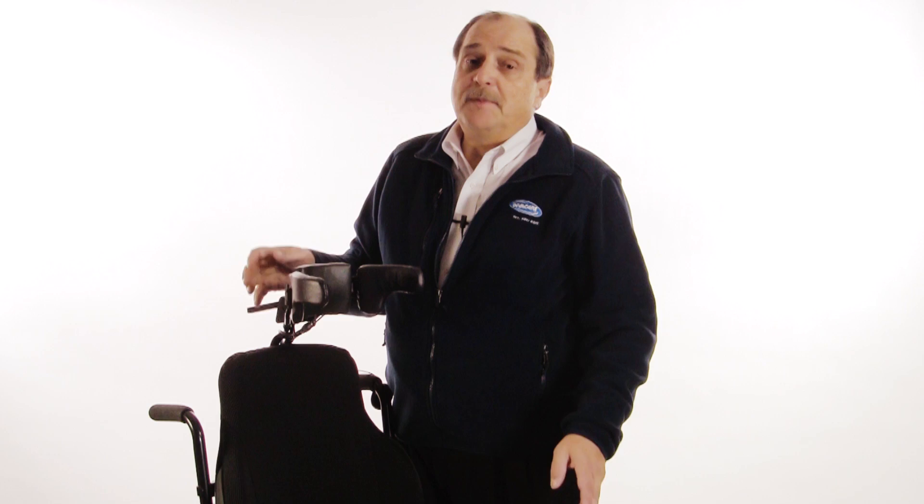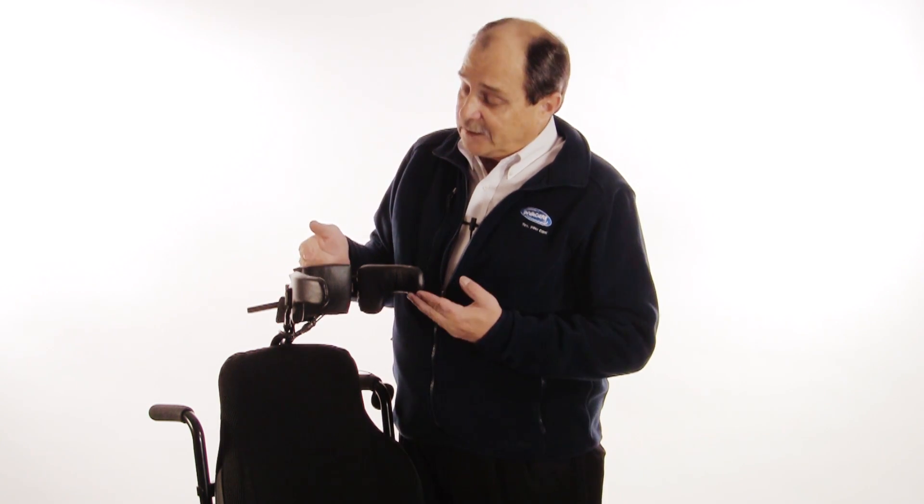This short video is about RIM, or three-quadrant driving. Some power wheelchair driver controls, like head controls, offer only three active quadrants for driving the chair: left, forward, and right.